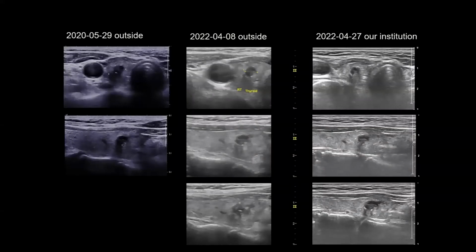So, how would you determine this nodule's margin? I read this nodule as including the surrounding isoechoic area, and third, this is a hypoechoic change from internal degeneration. The lesion was diagnosed as benign at FNA.